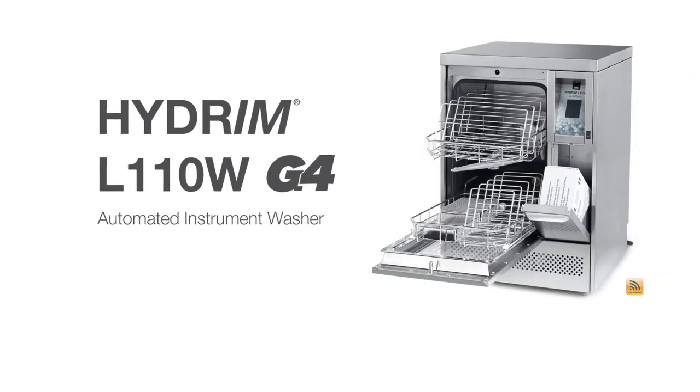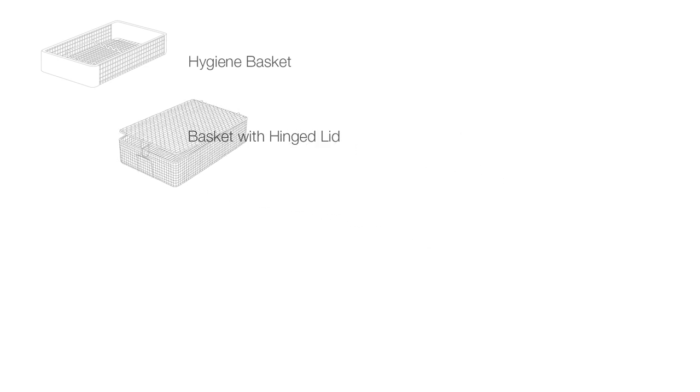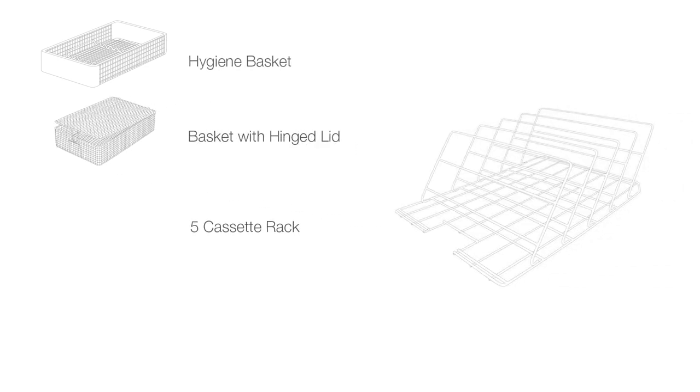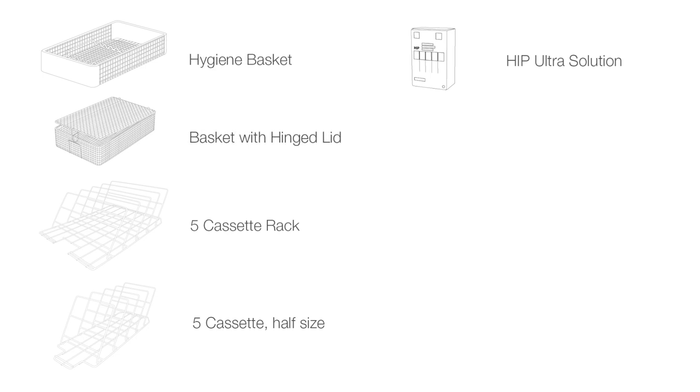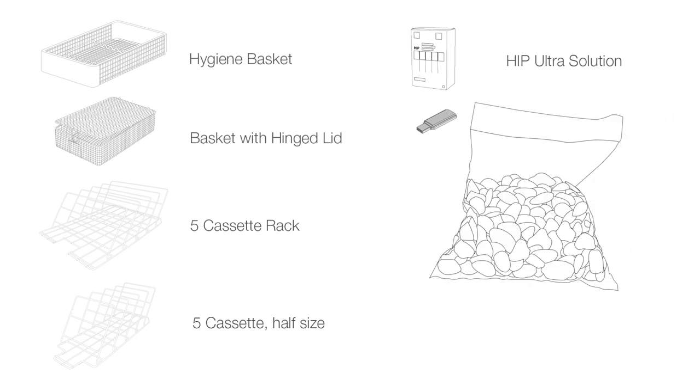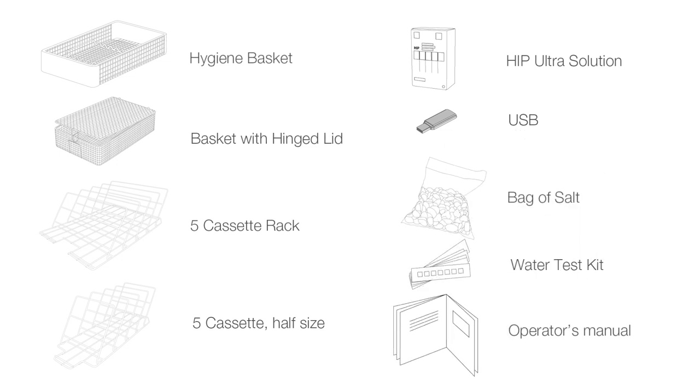Your Hydrum L110 instrument washer comes with the following items: hygiene basket, basket with hinged lid, 5-cassette rack, 5-cassette half size, box of HIP cleaning solution, USB, bag of salt, water test kit, and operator's manual.